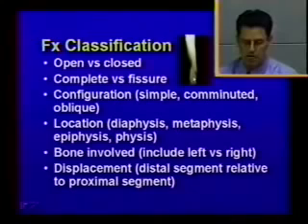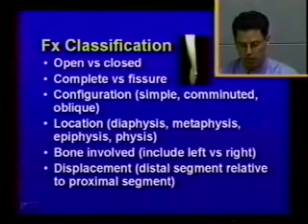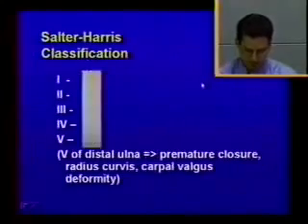They also comment on the degree or the direction of displacement. So in this case, we're looking at a craniocaudal view of the tibia and fibula, and the distal fragment is what displacement refers to. At least from this one film, we can tell that it's laterally displaced. We'd need the other view, the lateral view, to determine whether it's cranially or caudally displaced.